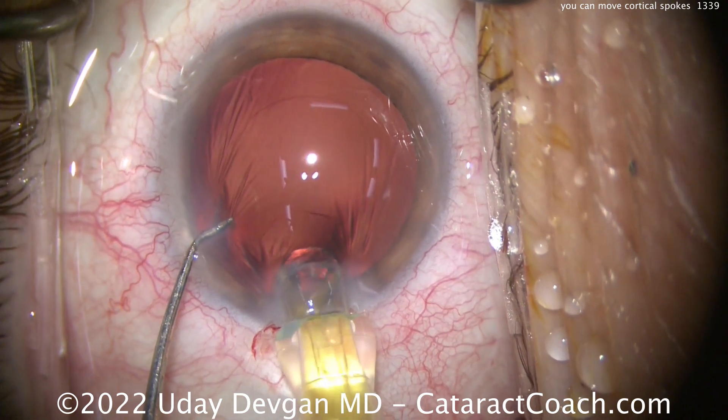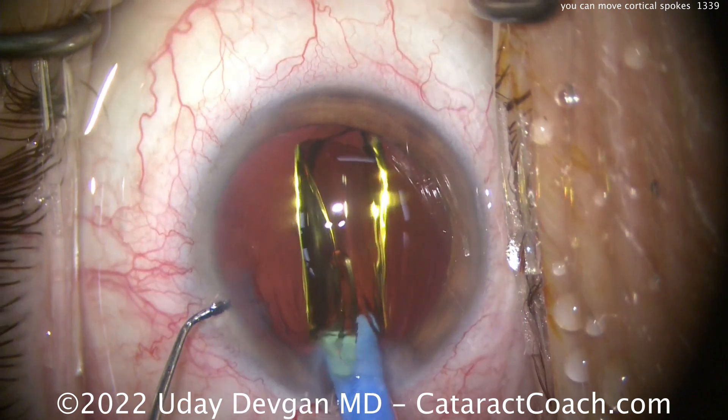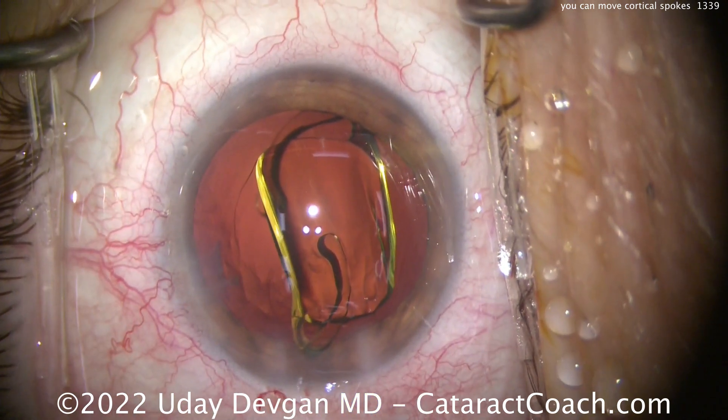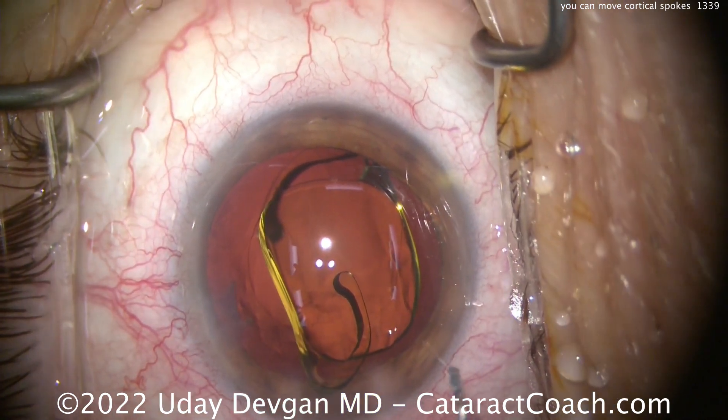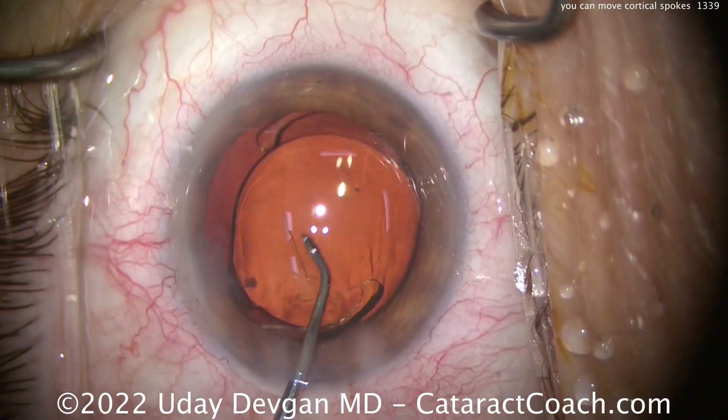Once we get the lens in — this lens has an optic of six millimeters — as the lens goes in, we'll be able to judge that rexis size. As we measured during its creation using forceps, it should be just about five millimeters. And we'll get that lens delivered in the capsular bag.